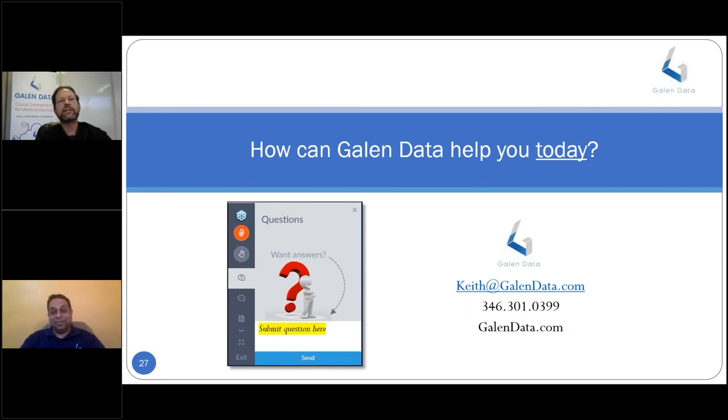And I want to wrap back to a statement you made when you were talking about software, and that is the SBOM, the Software Bill of Materials. Just as it's important, every screw, every resistor, every chip in your medical device that's hardware, it's just as important to have that same inventory of software components. Some of our partners we can introduce you to not only provide that capability, but also monitor in the general public vulnerabilities that those software components may have as they're discovered and feed that information back to you. So our partners are here to help.